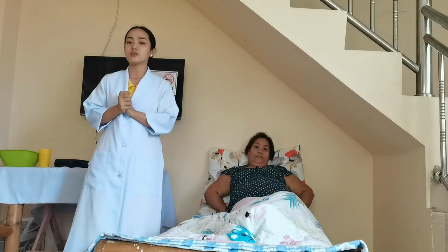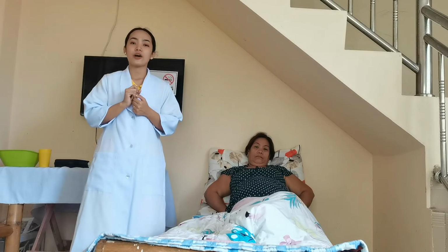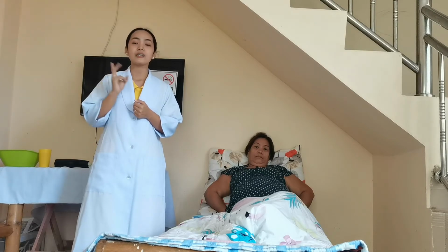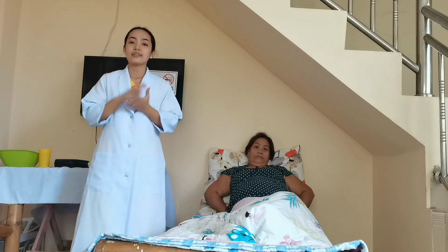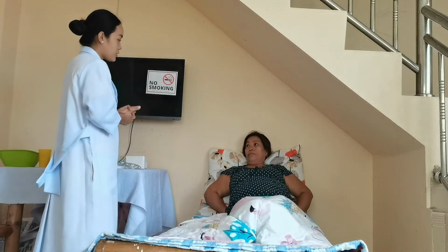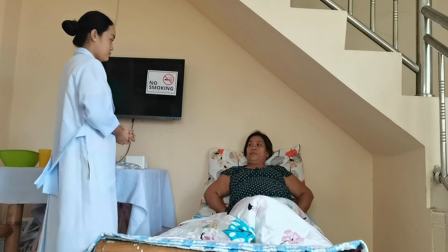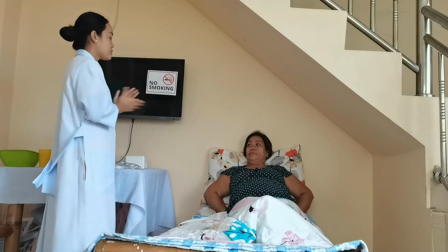So once we are done doing that, we will now identify the client using two identifiers. So we can use the name of the client and the birthday, and then explain the procedure to the patient and the client. So, good morning po ma'am. Ano po pangalan niyo at birthday? Aira Lopez, September 27. Alright po ma'am. So, I am Aira Lopez po, your student nurse for today.